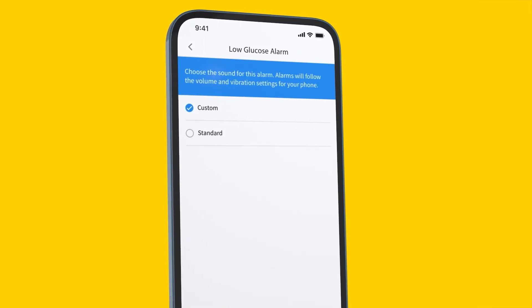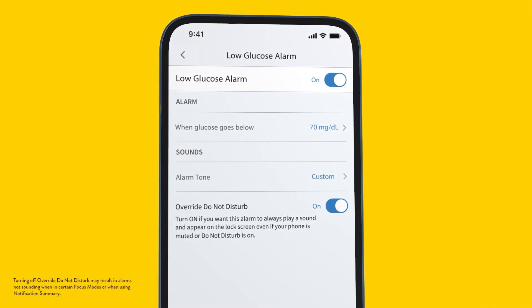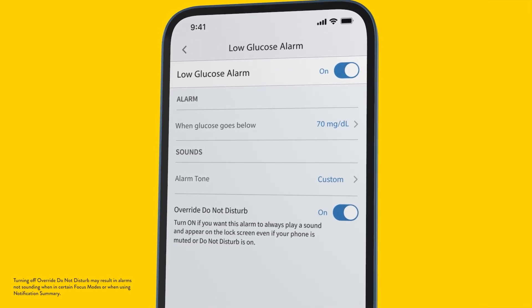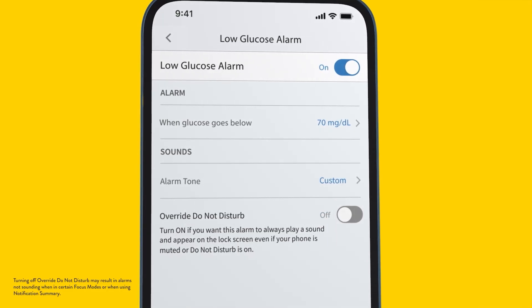Keep in mind the sound level on your alarms will follow the volume and vibration settings for your phone. Note that the low glucose alarm is set to override do not disturb. If you do not want the alarm to always play a sound and appear on the lock screen, you need to turn off override do not disturb. You can also set up your high glucose alarm using the same steps.